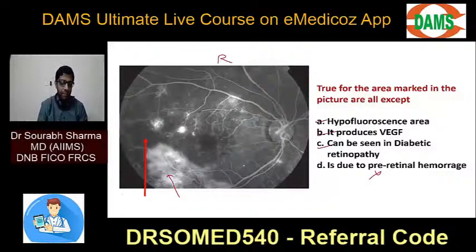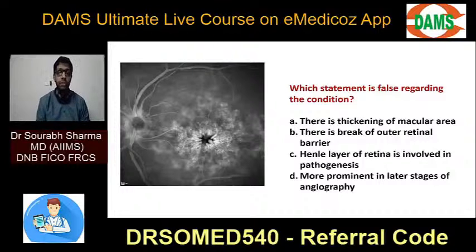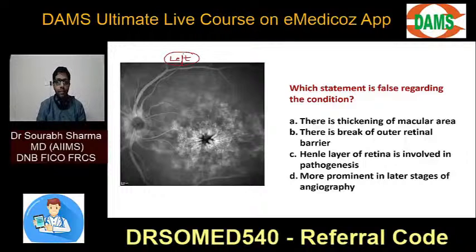Yes, Indrani. Excellent. Can someone answer this question now? Very good. Which statement is false for this condition? What is this condition? Which eye is this? And what is the condition? This is spot diagnosis now. This is the optic disc. This is the fovea. Right or left? So left, angiography, sir. What is this? Some pattern I told you today. There is some pattern. What is the pattern? So radial configuration. Yes, sir.